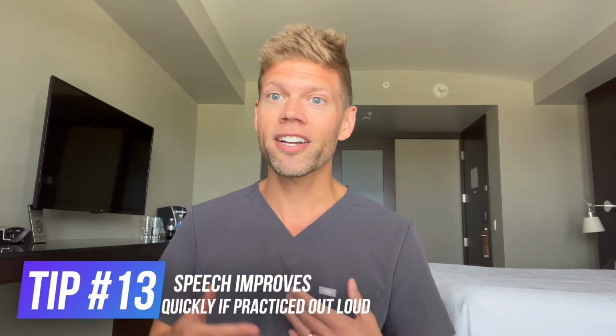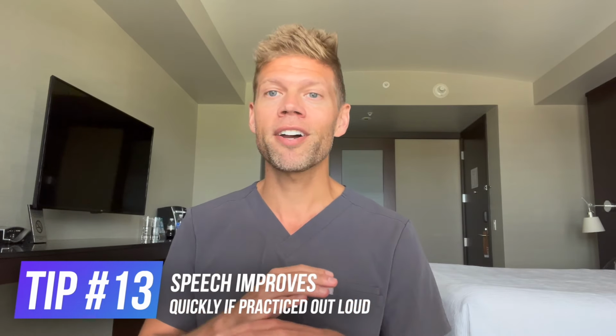A lot of people ask if speech is affected with your Invisalign. Maybe for the first few days, it might take an adjustment period, but as long as you're practicing out loud and you're talking, it usually gets better. Some people talk perfectly normal right away. If you're like me, it took me a couple days.